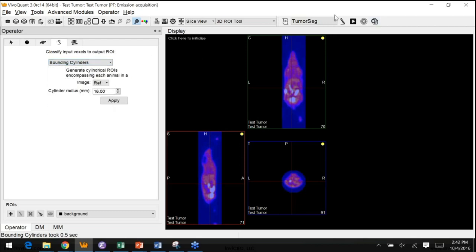This is where this peek tool comes in handy. This little magnifying glass over a paper. I can use this to find any widget in my operator and figure out its name. The reason is I'm going to basically reference all these drop-downs by their name, and I can set any option in there.